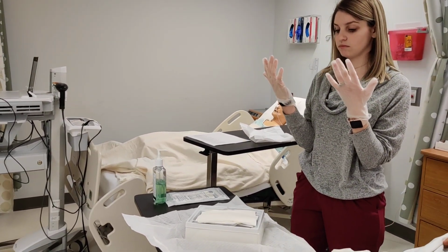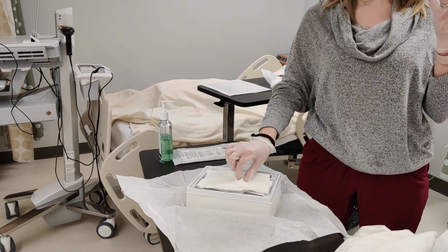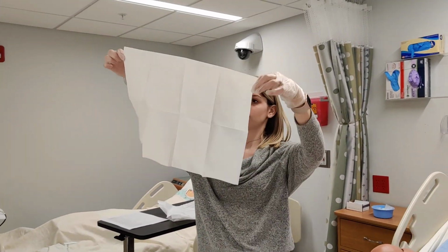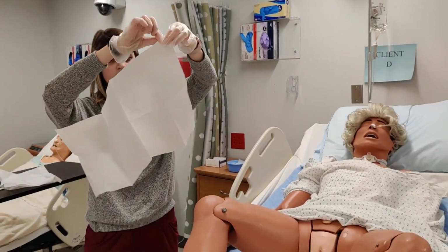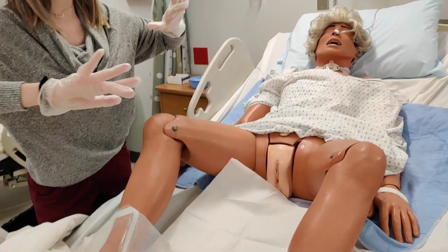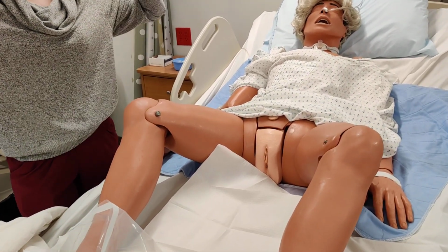Once the sterile gloves are done, there is a drape that is next on top of that kit. She's going to take that drape out. She can touch that anywhere because her gloves are sterile. And she's going to place that down on the bed without touching anything else. So that was an oops right there. We saw her contaminate that package.